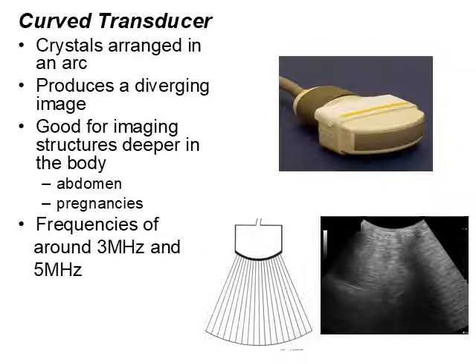So most things that we're going to be looking at that are at depth, so if I'm going to do an abdomen scan, if I'm going to do a pregnancy scan, if I'm going to look at bladders, livers, pancreases, kidneys, anything like that, I'm going to need to use my curved transducer. Don't even think of looking at the linear one, I just jump straight to my curved transducer.